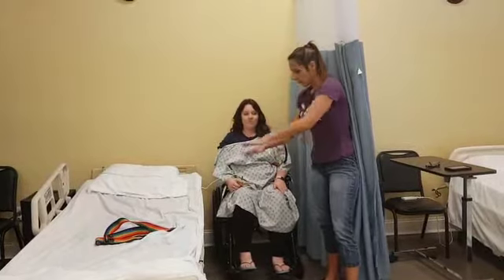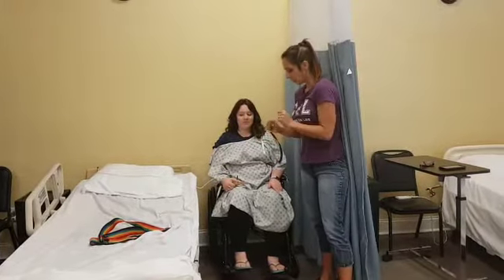You have your call light. You're comfortable. You don't have to worry about the bed being locked — we already checked that prior to getting them up. Pull back my curtains. Wash my hands.